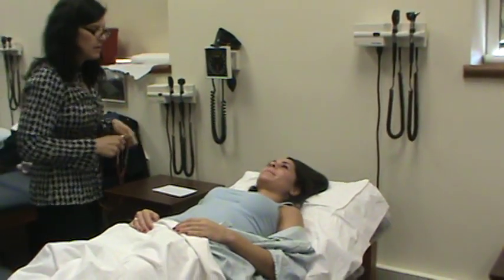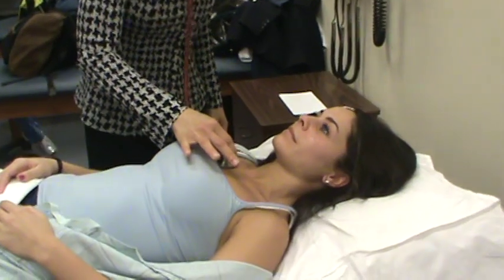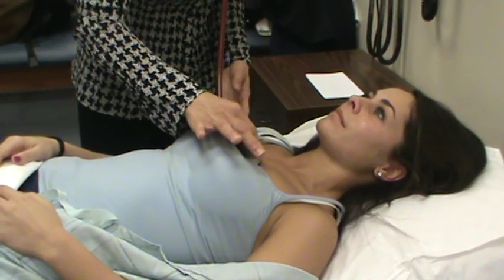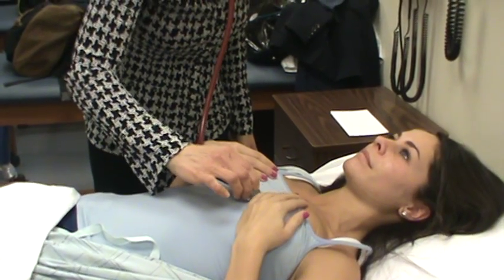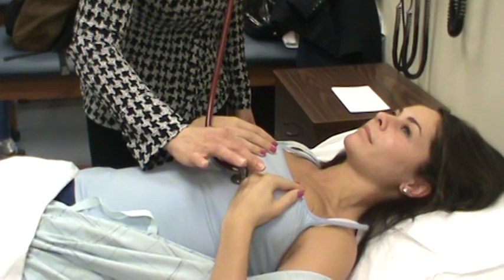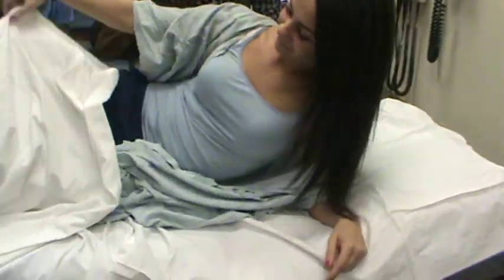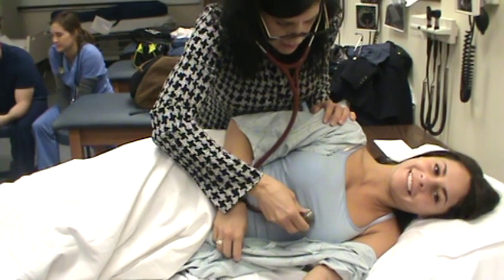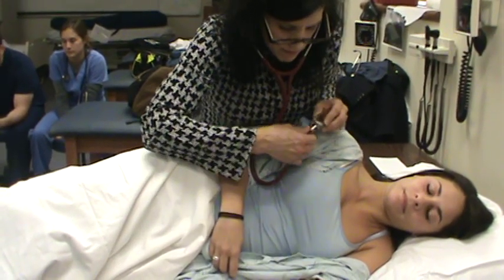Now I'm going to listen to your heart again. I'm going to start up in the right second intercostal space at the aortic, using the diaphragm first. Right second intercostal is aortic. Left second intercostal, pulmonic. The third is Erb's. Can I ask you to move your breasts to the side please? Fourth, tricuspid. Fifth mid-clavicular line for the mitral. I'm going to ask you to roll on your left side. Right about where I felt the PMI, I'm going to listen again while she's lying on the left side — first with the diaphragm, then I'm going to flip it around and listen with the bell.